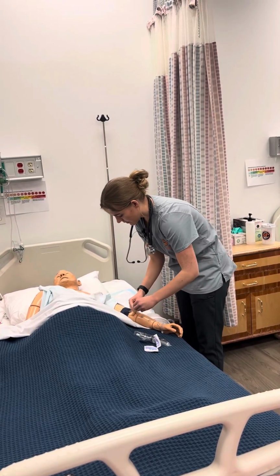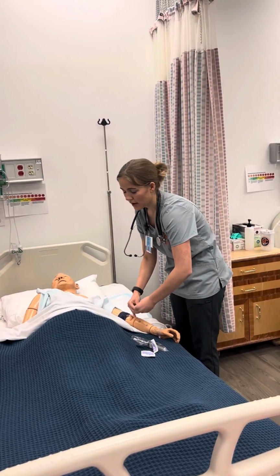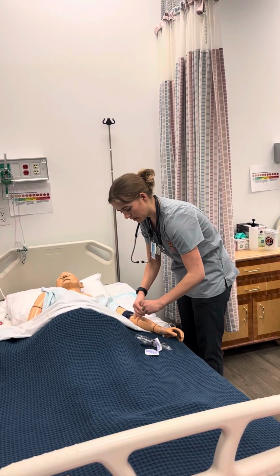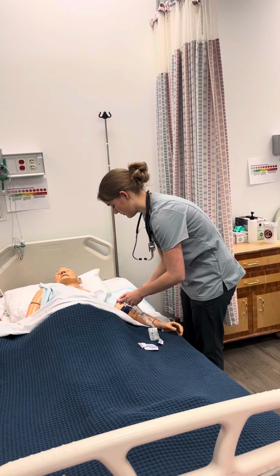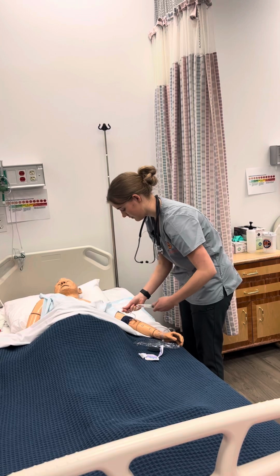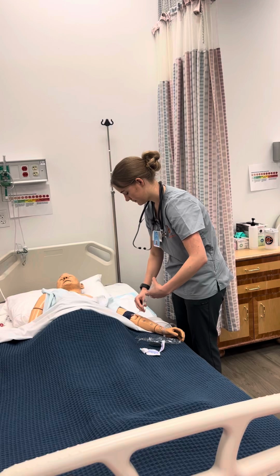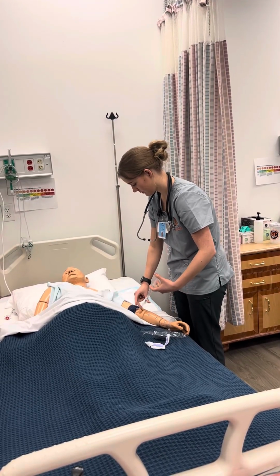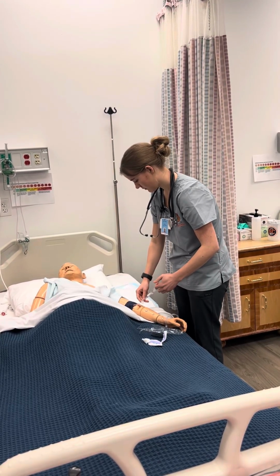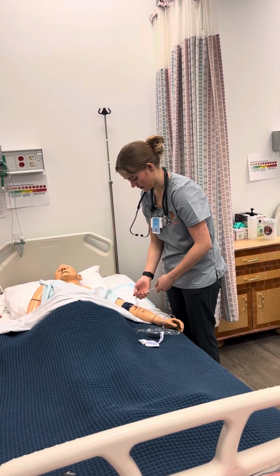And at this time, I would also give any medications needed before the transfusion, usually 30 minutes prior to it. Make sure to scrub that real nice and good. Okay, that flushes great. Go ahead and just take that off for a minute.